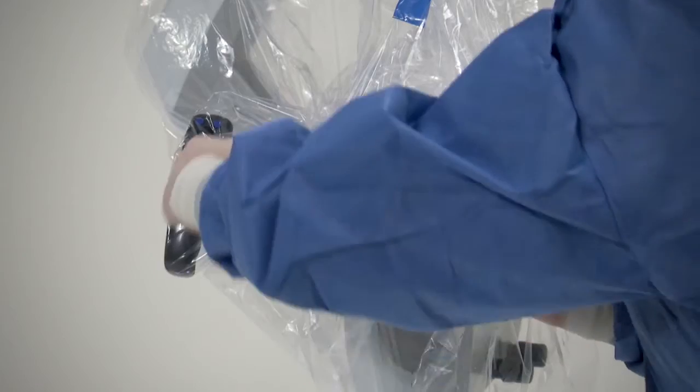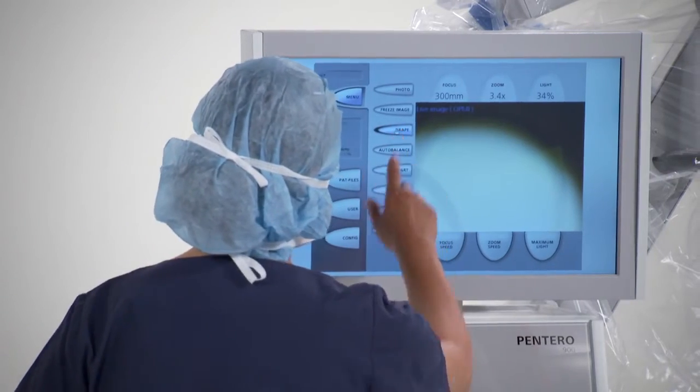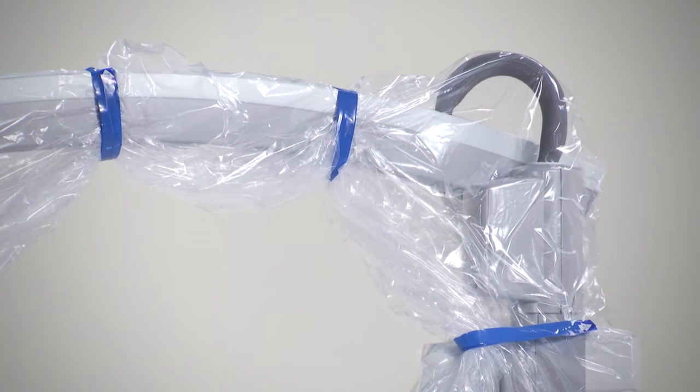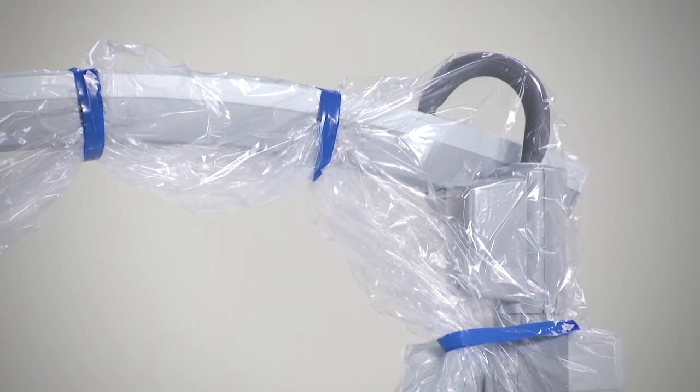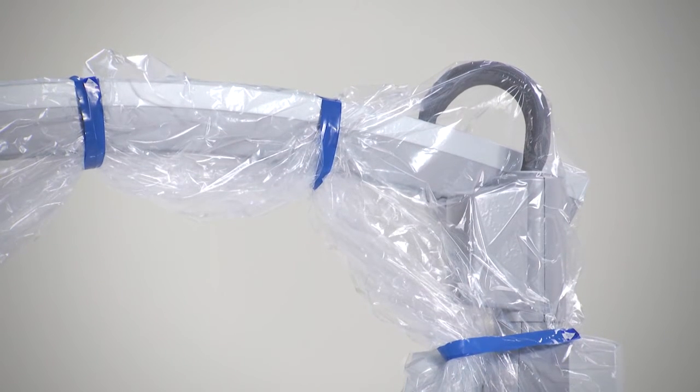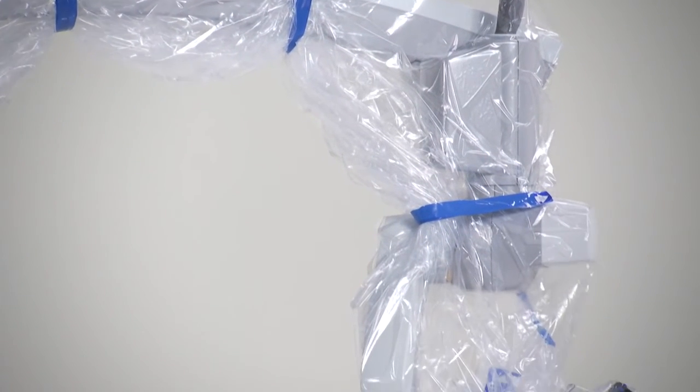If the microscope is equipped with auto drape, press the drape button in the main menu. This activates the pump. The pump system increases to maximum power for two minutes to extract the air from under the drape, and then switches to a lower speed to maintain air levels.